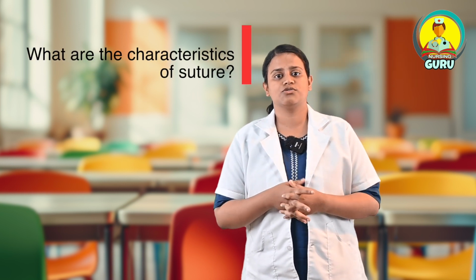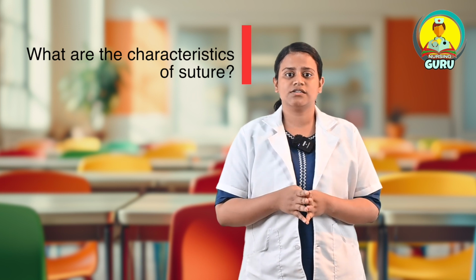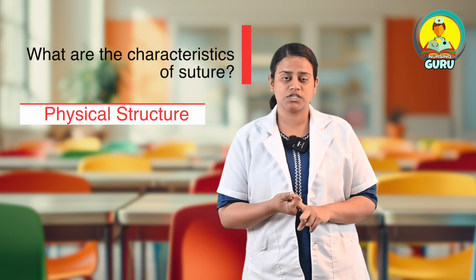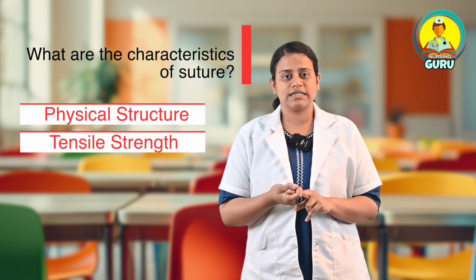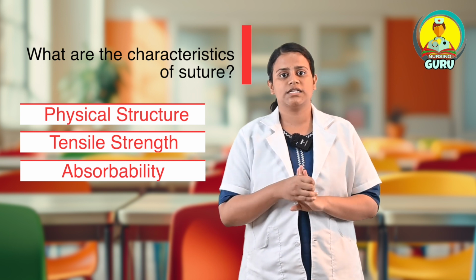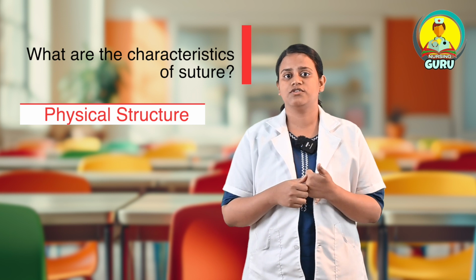Next we will move on to the characteristics of suturing. There are many characteristics, but we will discuss only four. First is the physical structure of the sutures. Second is the tensile strength. Third is the absorbability, and the fourth is the biological behavior. First, the physical structure of the suture.